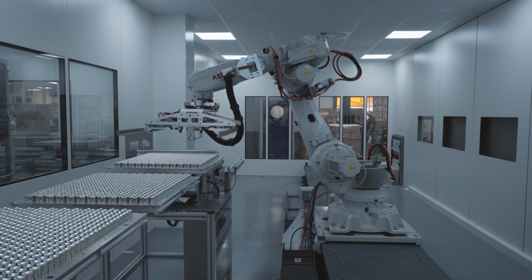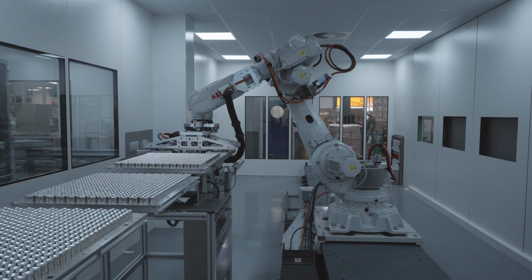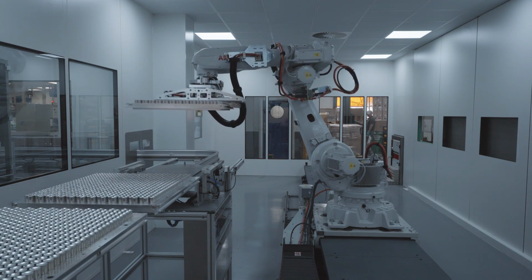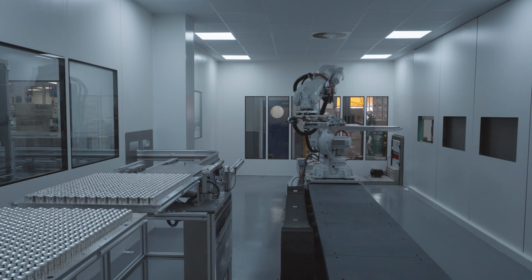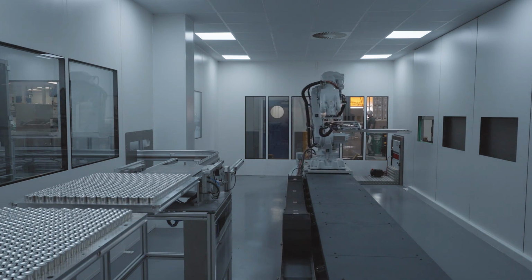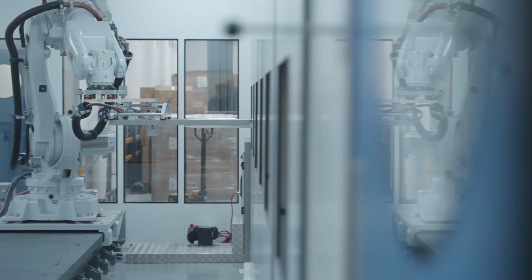The jig is then transported onto the monorail through to the plasma processing clean room. The robotic arm then collects the jig tray and transports it over to the plasma pod and places the jig into the pod.